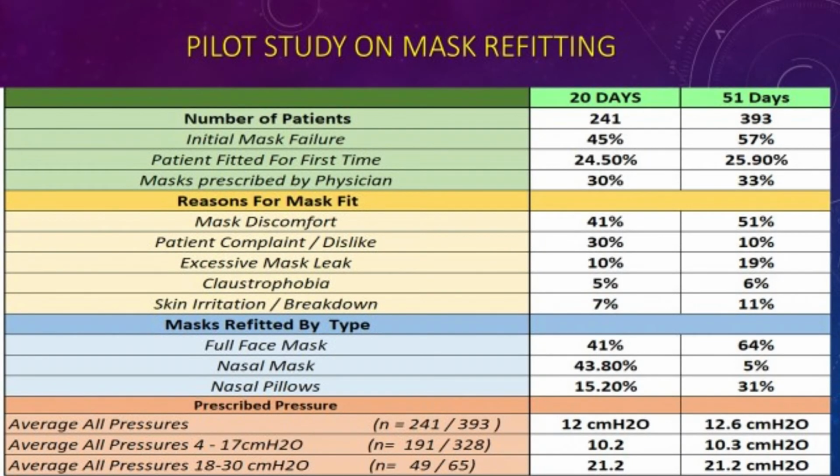And this was a pilot study that I did at the University of Michigan MediQuip home care company in 2017. At that time, we were doing about 300 setups, CPAP and BiPAP, per month, and we had a very generous mask exchange policy based upon the manufacturer's mask promise and also the willingness of the insurer to replace the mask.